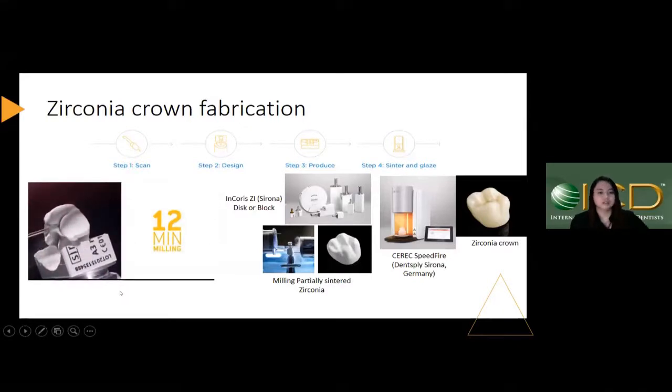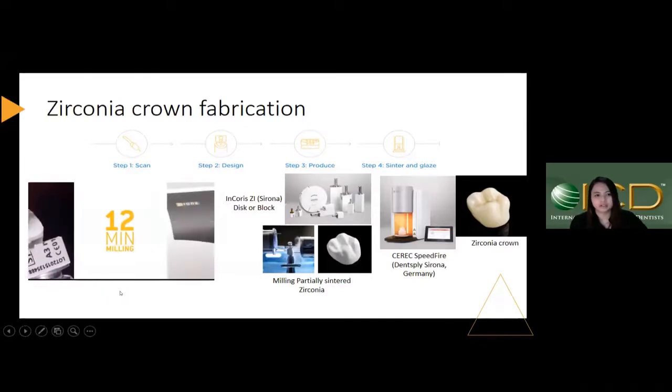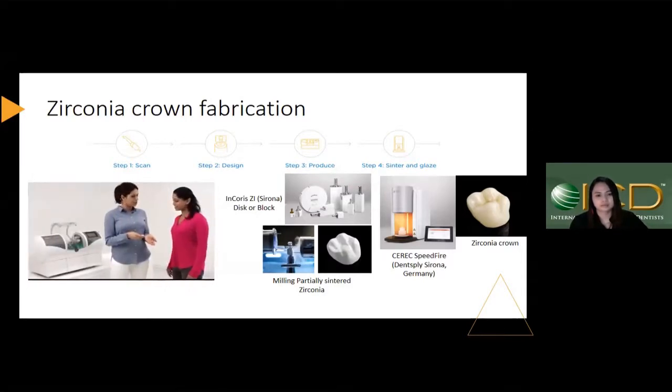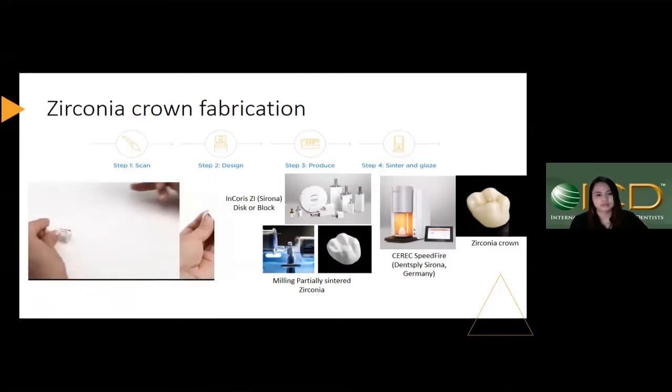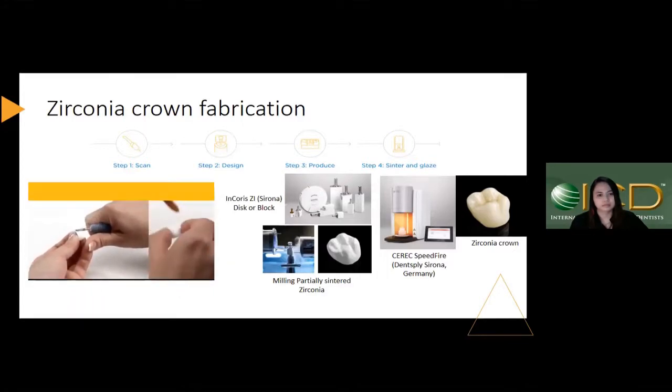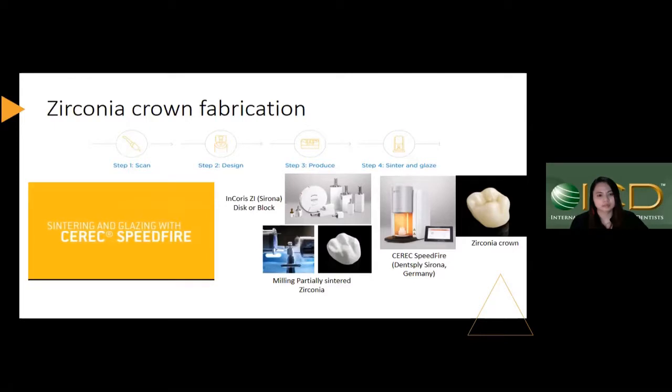After designing, we mill the zirconia crown. And then we use a sintering machine.